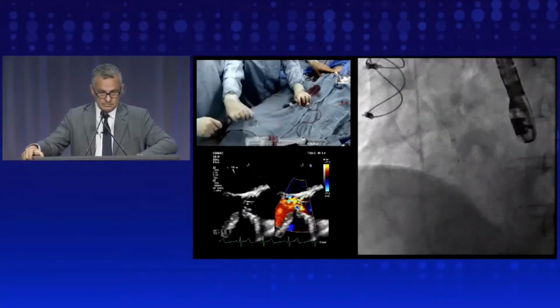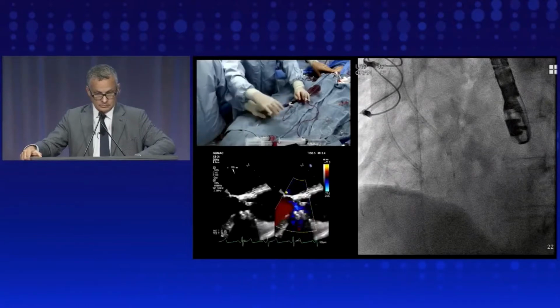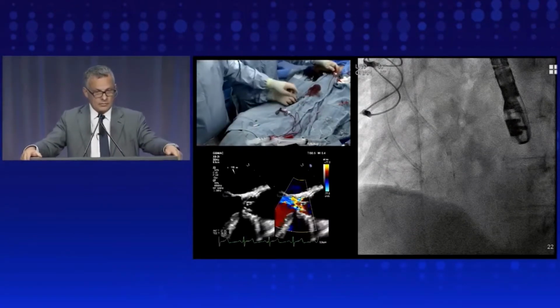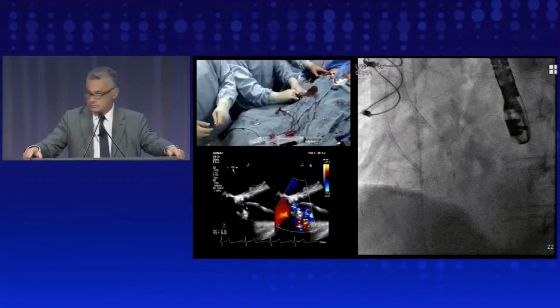Any changes, Burkhardt, you'd like to note as they're taking the catheters out, in terms of the way the leaflets look? Yeah, there seemed to be more mobility on the right coronary cusp, as you see here. The left picture is color compare image. The right coronary cusp is more on the bottom of the screen there. And you see still the catheter perched on the left coronary cusp.